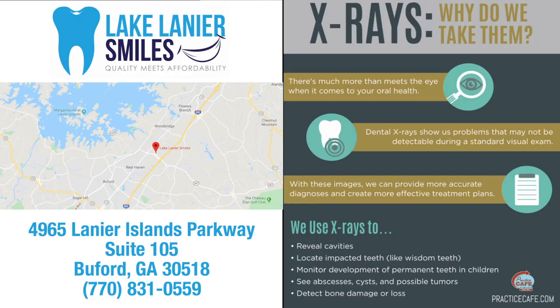With our natural eye, we cannot detect anything going on under the gums. So that's why we take the x-rays, so we can see what's going on under the gums. And also to have a more accurate diagnosis and to create a more effective treatment plan, we need the x-rays. And if you have any questions about x-rays, you can talk to us when you come for your dental visit.